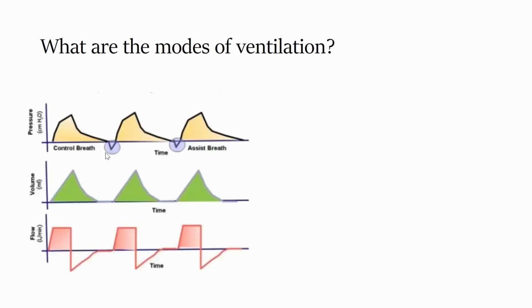So what do these sharp spikes indicate on a pressure time curve? What does it indicate? Can anyone answer? This case, for example, has a sharp spike, and this one here doesn't have any sharp spikes. What does it mean? Good. Patient trigger. So the patient is triggering.